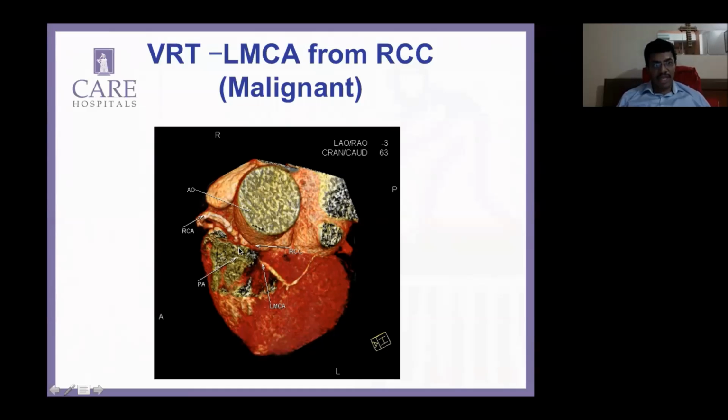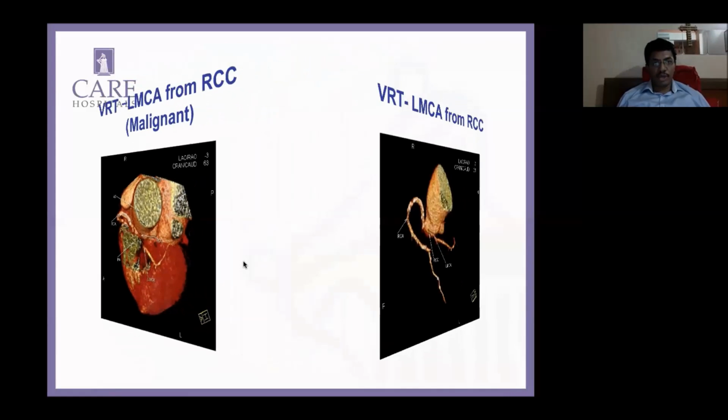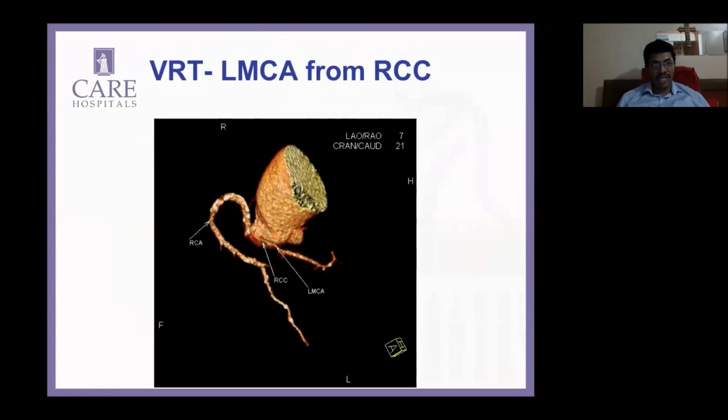And coming in from the right coronary cusp is a long left main from the right sinus, with exactly an interarterial course. That's why I didn't cut off the pulmonary from there. I got another picture between the aorta and the pulmonary artery. So an anomalous origin of the left system. Now this is a very beautifully cut out image.